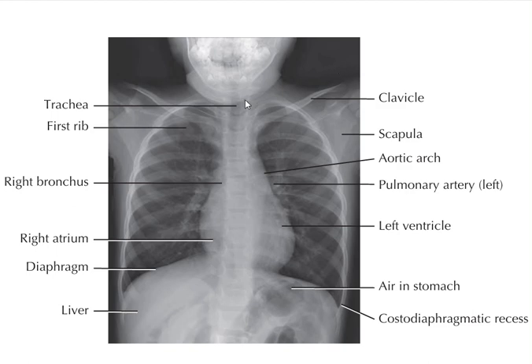This is the radiology of the chest. This is the trachea, this is the first rib, this is the clavicle, this shadow is for the scapula, and here is the aortic arch.